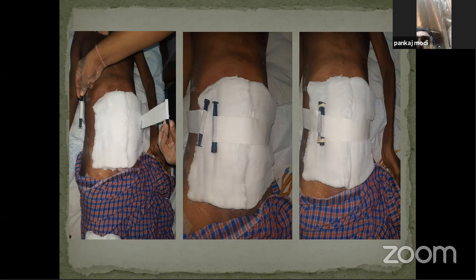And at that time, the purpose is why we are discussing this. In today's scenario, its value has decreased. The reason is we have a fistula manager. Understand this point. When the fistula manager is not available, you have to improvise. One of the important improvisations is the PRN dressing. The reason is that it decreases the workload.